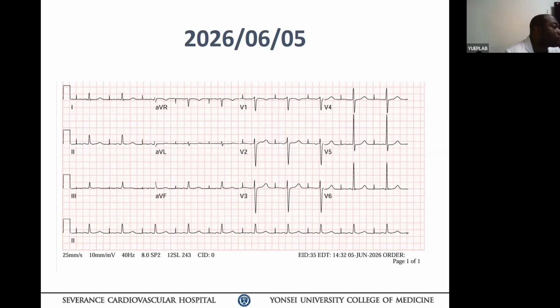You implant the pacemaker, and suddenly the patient starts having tachycardia. Then you start figuring out why it happened. Your answer is going to be an automatic trigger, or a delayed conduction re-entry. It's possible.